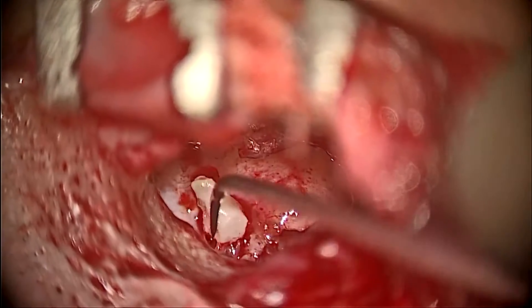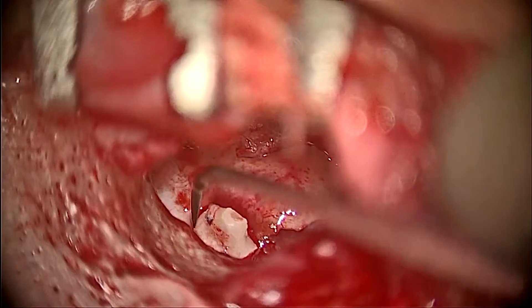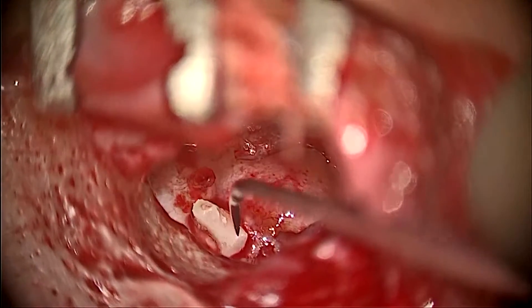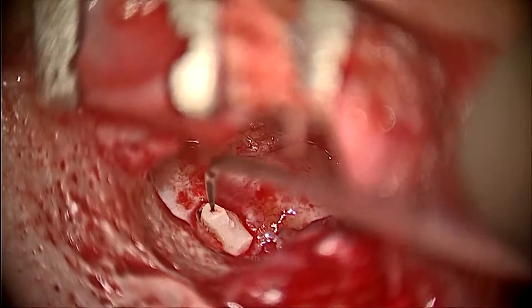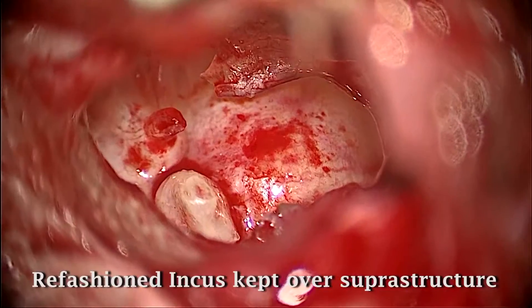Once the incus was refashioned, it was placed over the stapes head. The stability of the joint was checked and a spring-like action was seen because of the stapes.